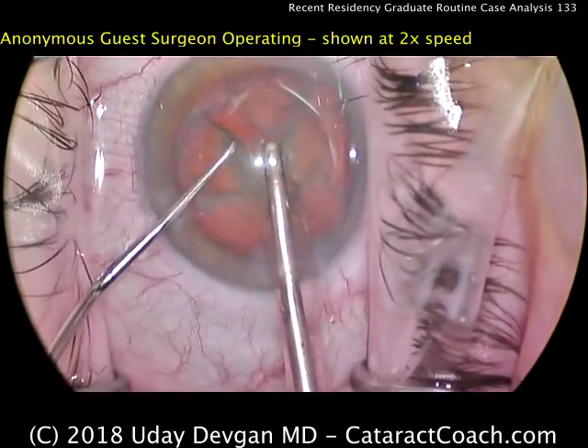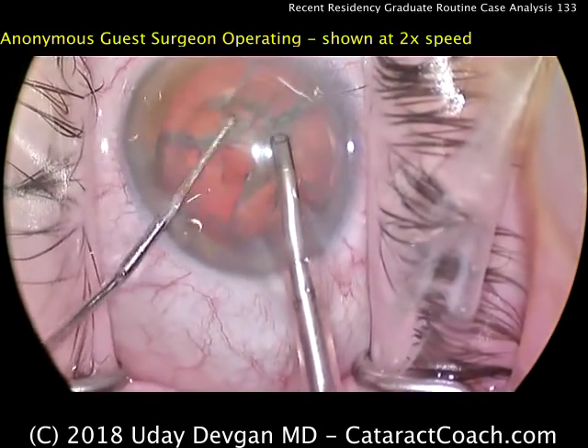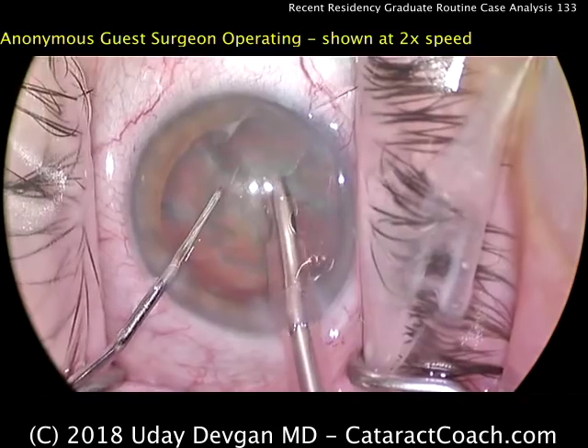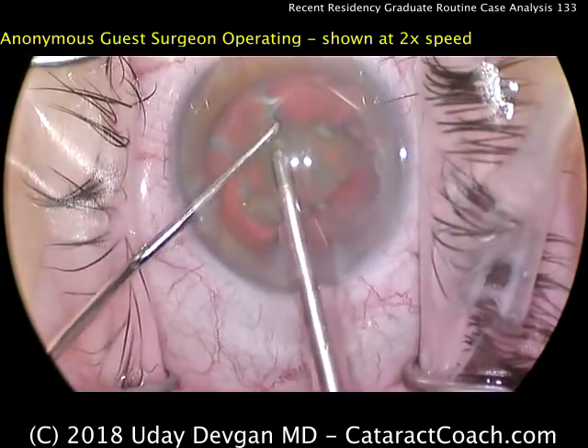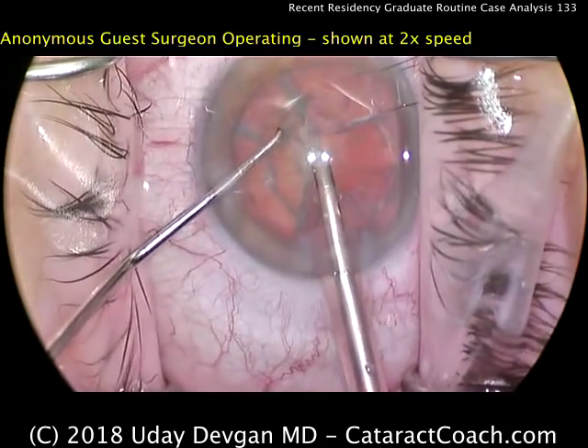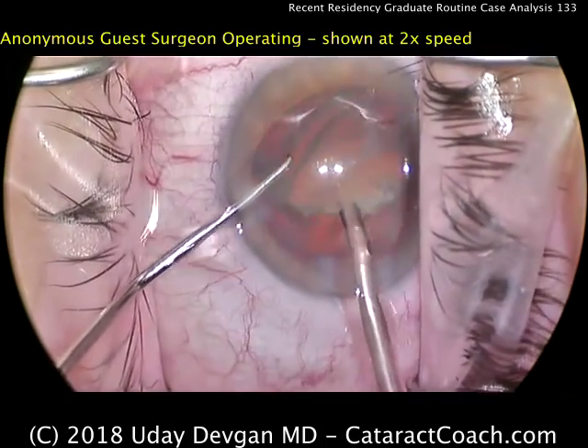I like that the doctor has learned how to do phaco chop — that's a very good technique, of course. Further splitting these nuclear pieces, buzzing in again, bringing them up, and if need be, further chopping. Again, efficient use of the phaco probe. This is quite good.